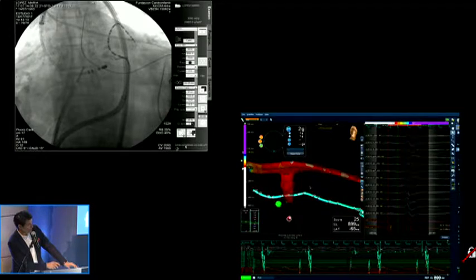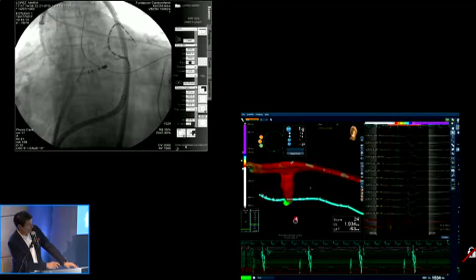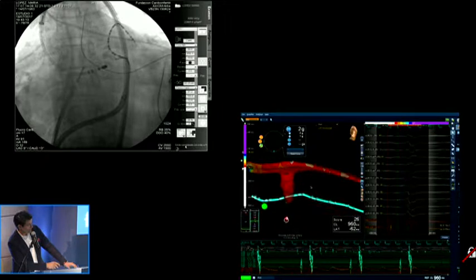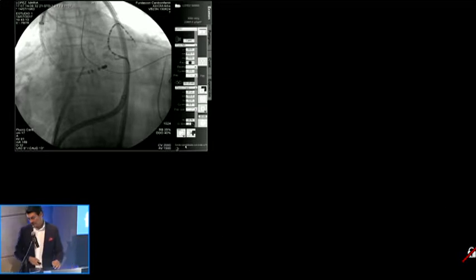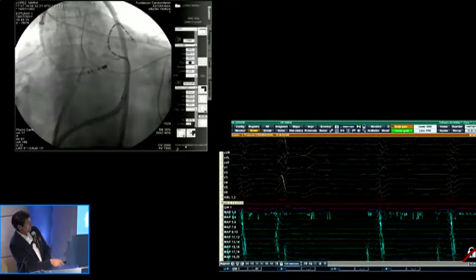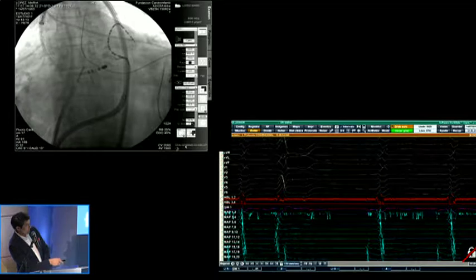Show us the electrograms in the revision screen, because what's important is for you to learn how to map here. So we need the electrogram revision page. Here you have the three modalities. You have the decapolar catheter, the endocardic ablation catheter. You must raise the gain.